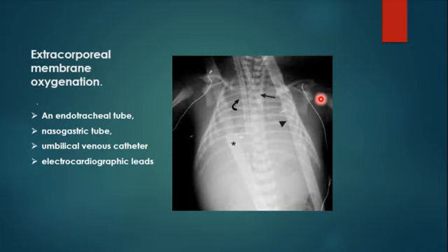The blood comes back from the machine to the artery, from the carotid. No, they put the catheter with the blood flow, like you do arterial catheterization of the heart, for example. With arterial catheterization, you can put it against or with the flow, according to the direction you like. You just put the catheter like that or like that. Whatever direction you like.